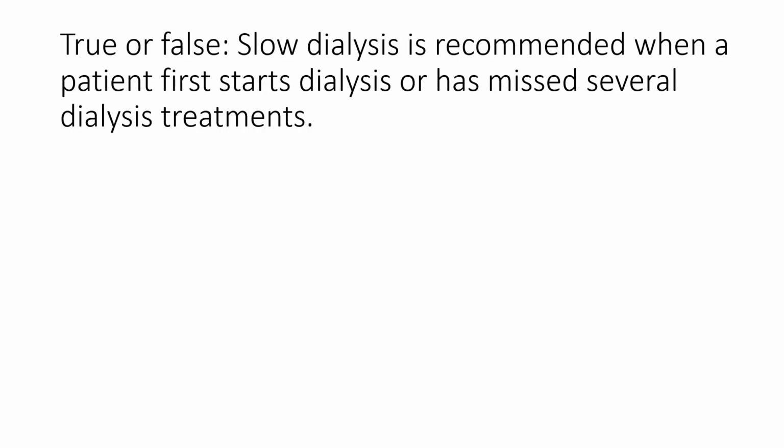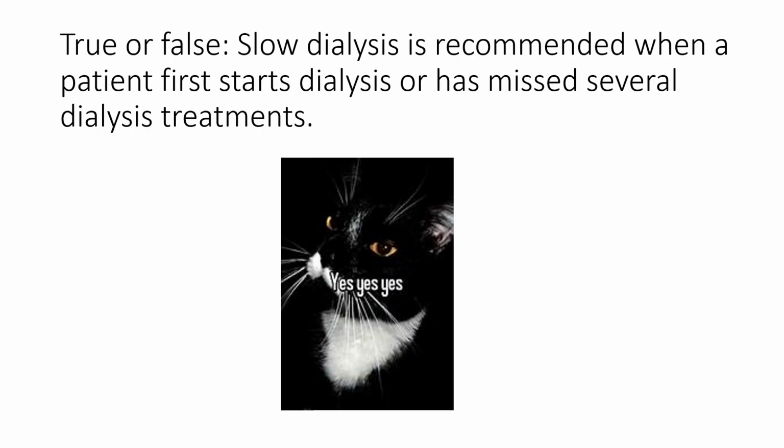True or false? Slow dialysis is recommended when a patient first starts dialysis or has missed several dialysis treatments. And the answer is yes. And this is because of the potential for something called dialysis disequilibrium.